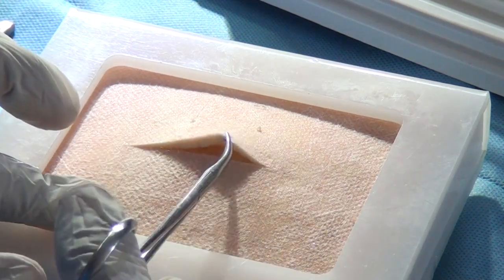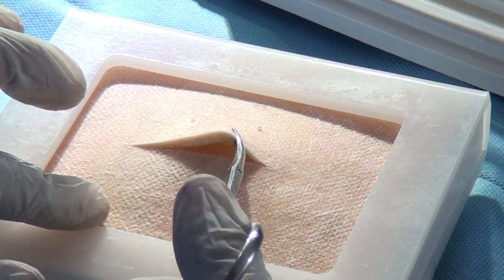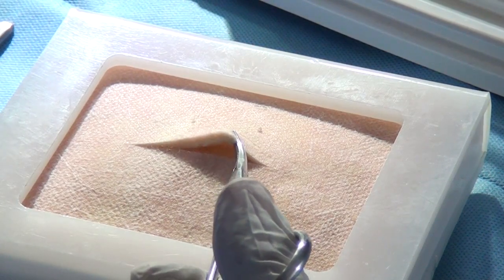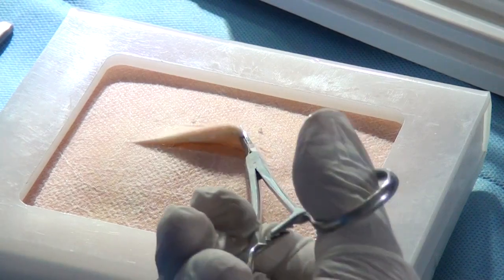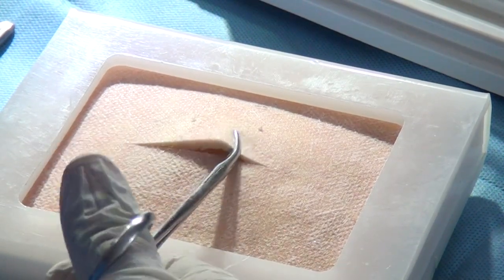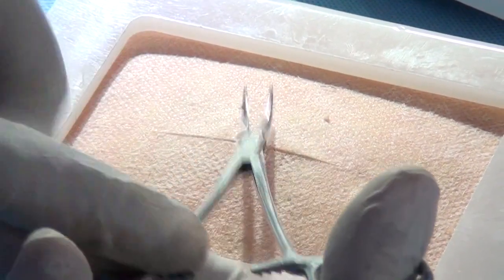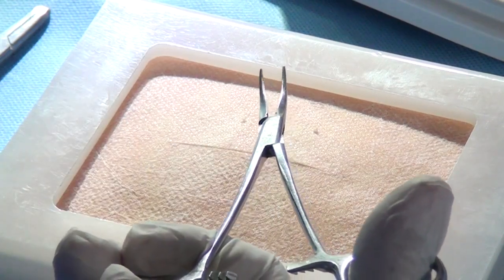And secondly, considering the depth and thickness of the tissue, if there is edema, use one ratchet, otherwise it will crush the tissue. You can see the imprint on the, this is rubber, even this gets crushed. The bowel will get totally damaged. So one ratchet at a time, therefore more than one provided here, so that the instrument can live that long.